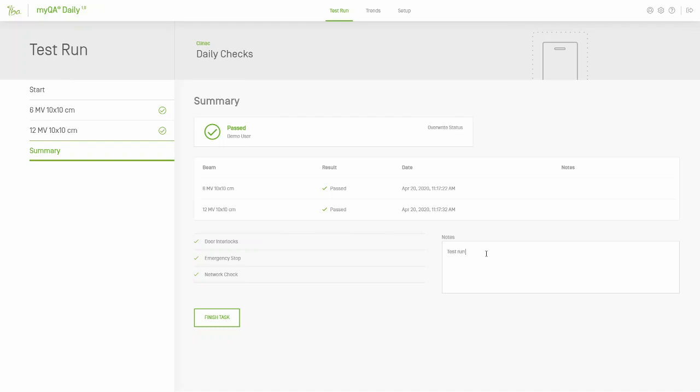To recap, we demonstrated how to add a MyQA daily device, a machine, a beam, and a task. And we showed how to perform measurements using either the single field method or in a sequence.